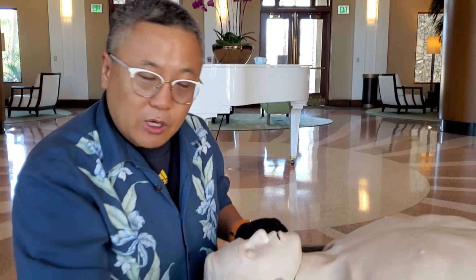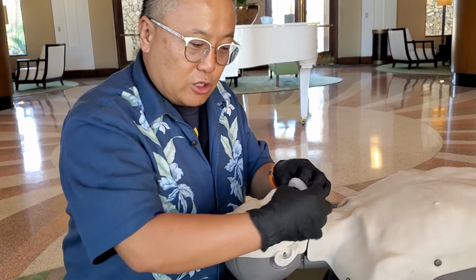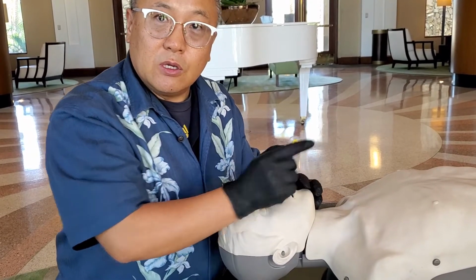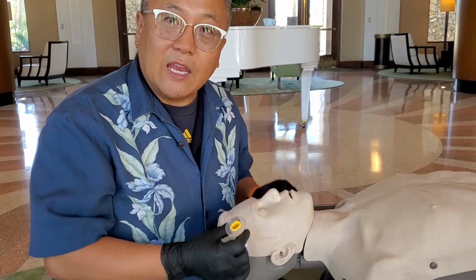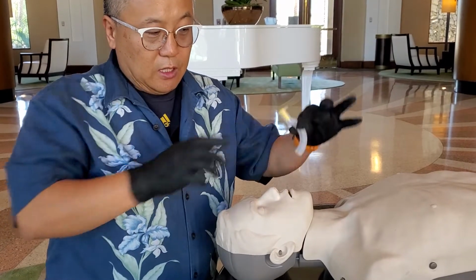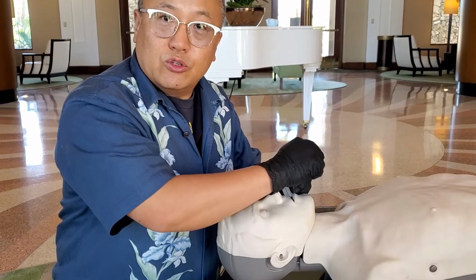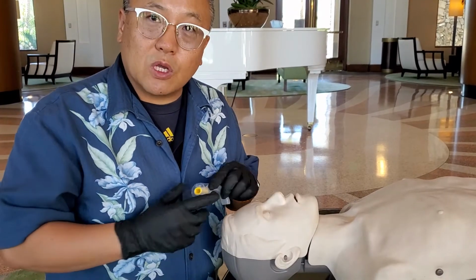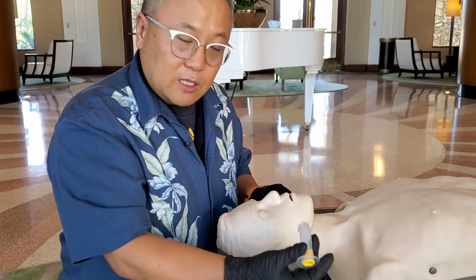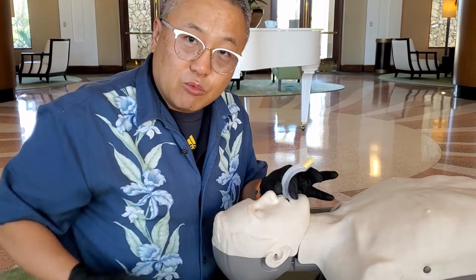There are three ways to put in the OPA, okay? Put it in at 90 degrees, go inside the mouth, and then turn it and push down. Then there's a second way, you can use 180 degrees, like this, go inside and then turn it and push down. This mannequin doesn't have a big mouth, I cannot put it all the way. So I'll show you one more time, it's 90 degrees. Go 90 this way and turn as you go inside the mouth, turn it and push it down.